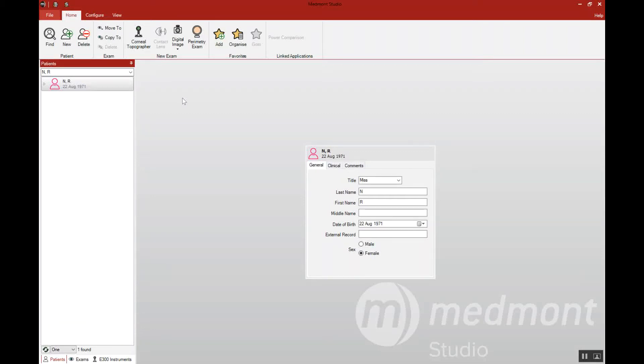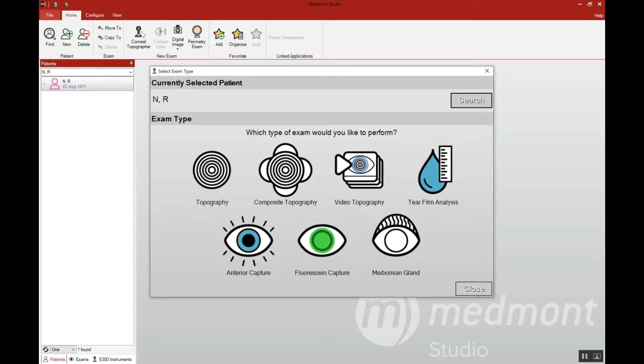This video reviews the topography capture in your Medmont corneal topographer. Start by creating the patient, then once selected, click on the corneal topographer capture icon.